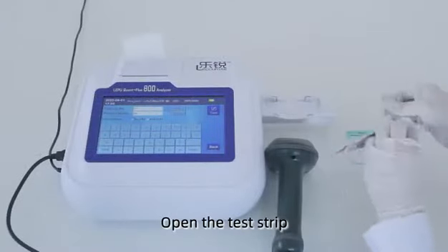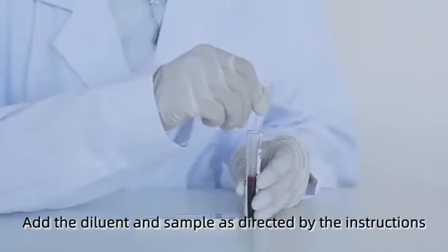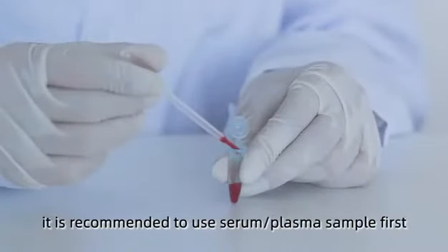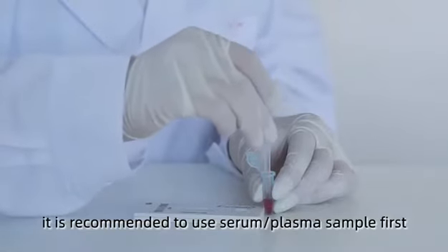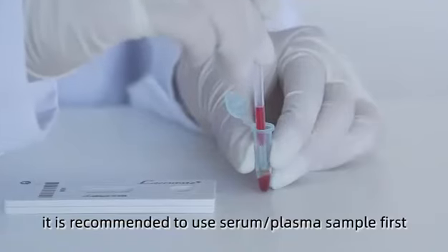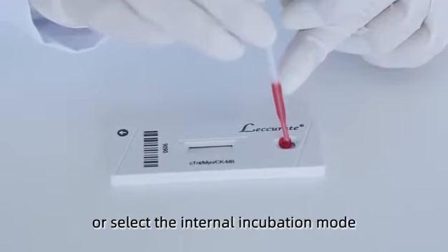Open the test strip. Add the diluent and sample as directed by the instructions. It is recommended to use serum or plasma sample first. Incubate at room temperature for 15 minutes or select the internal incubation mode.